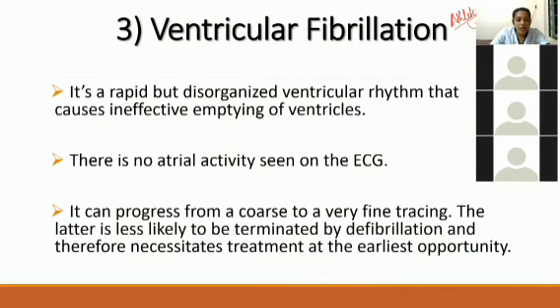It can progress from a coarse to a very fine tracing. The latter is less likely to be terminated by defibrillation and therefore necessitates treatment at the earliest opportunity. I already said the most lethal arrhythmia is ventricular fibrillation. When it reaches its peak, even with the help of the defibrillator we cannot revive the patient.